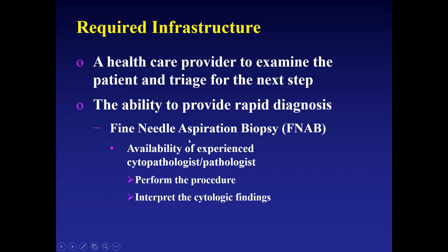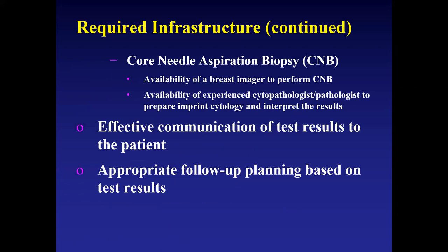And of course, when I'm talking about this, I'm trying to also bring another component of possibilities, and that is the use of digital pathology. It will provide a means for people who may not have the experience to just transfer that image to people outside of their area and seek help for providing that diagnosis from pathologists who have experience. We're actually hoping to be able to provide these kinds of services simply because this is the best and fastest way that you can provide diagnosis to the patients, which naturally subsequently leads to better management of patients with breast lesions.